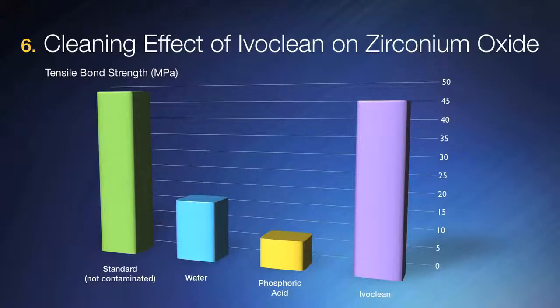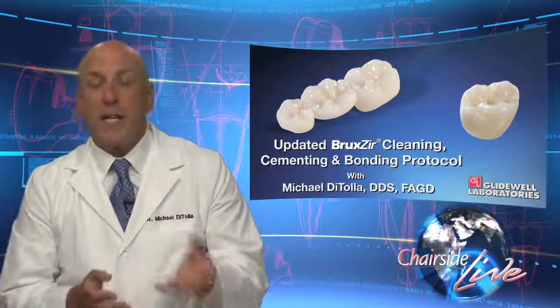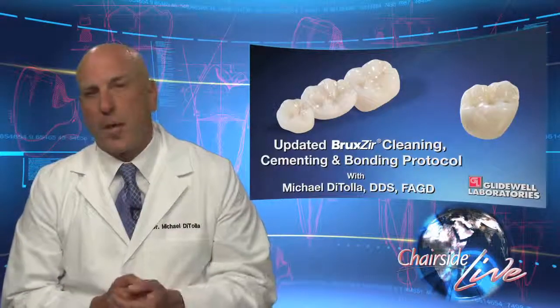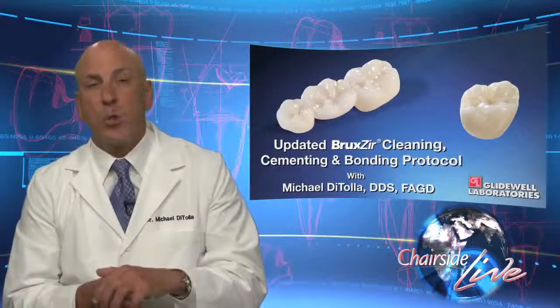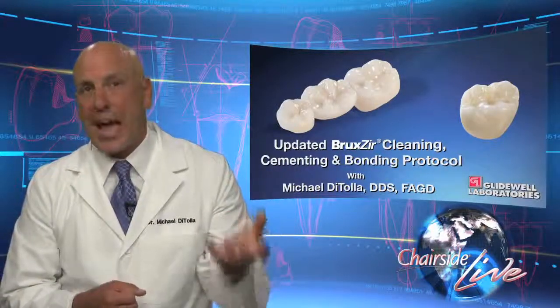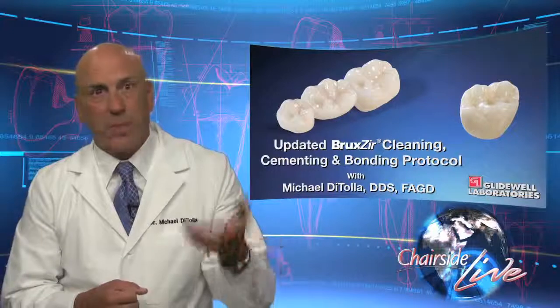So here's the bottom line after all that scientific justification for what I'm about to tell you. Anytime you try a BruxZir crown into the mouth, or a lava crown, any zirconia-based crown into the mouth, and it comes in contact with saliva, which is about 100% of the time, there's going to be salivary contamination of the inside of that crown that has to be dealt with, or there's a possibility that crown will debond and fall off one time, two times, three times.